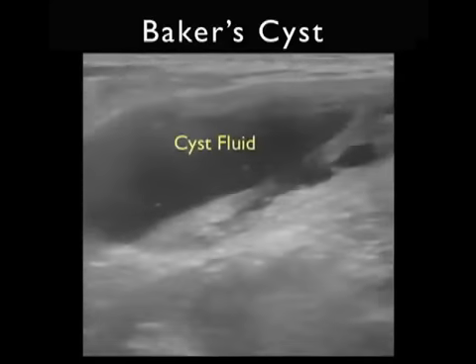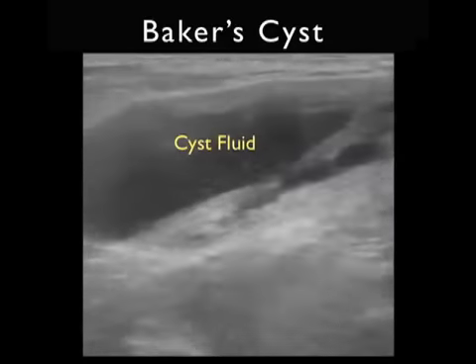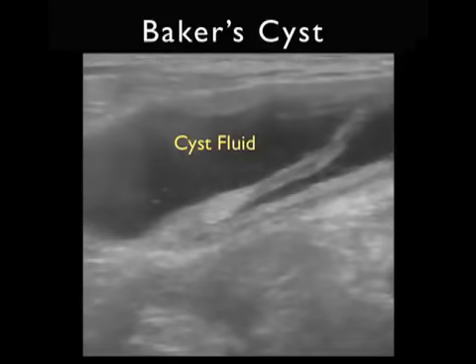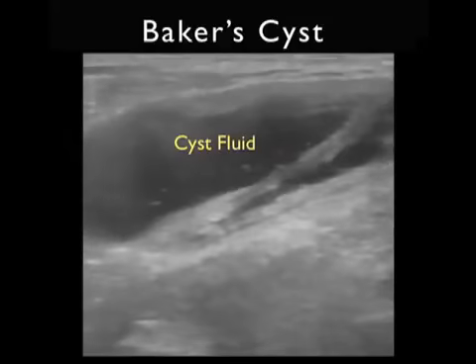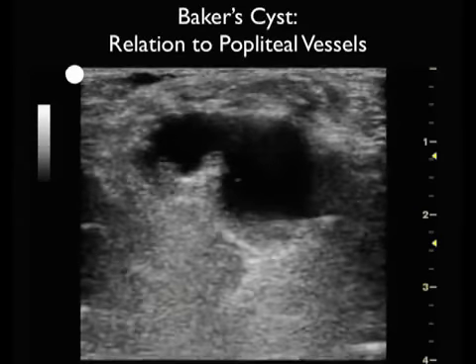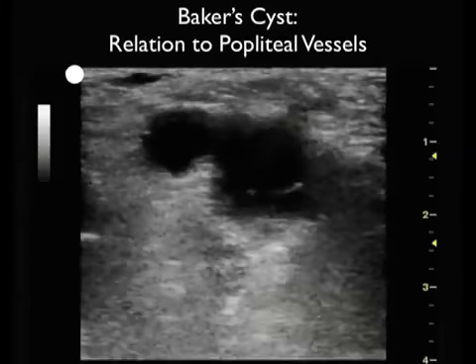This video clip demonstrates the typical appearance of an unruptured Baker's cyst. This Baker's cyst was found in the popliteal region of a patient who was referred to the emergency department for a swelling behind the knee. Here we see the typical appearance of a cyst, that is that of a dark or anechoic fluid collection on bedside sonography. In this video clip, we're going to change the depth of the ultrasound image to better interrogate the Baker's cyst in its relation to the popliteal artery and vein.